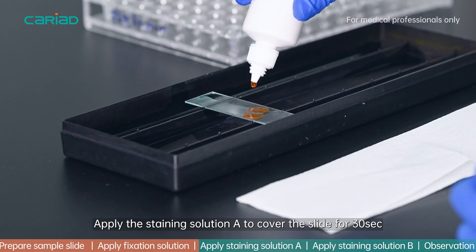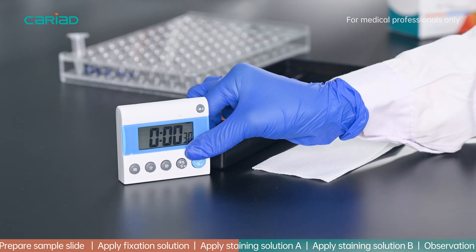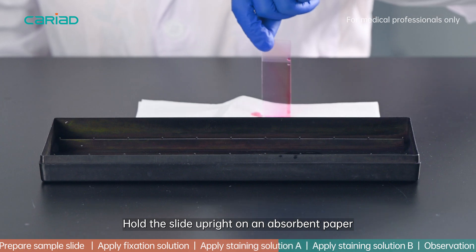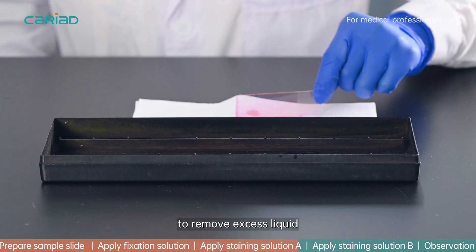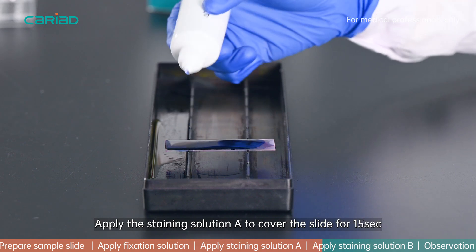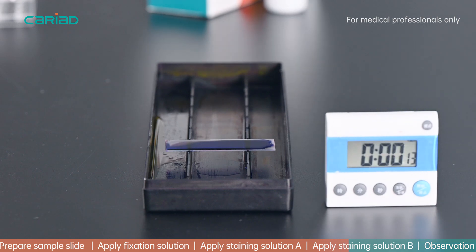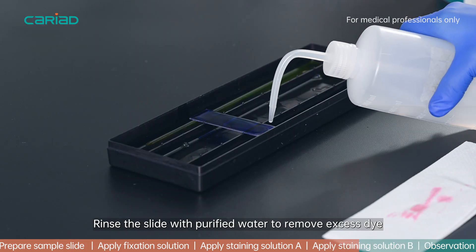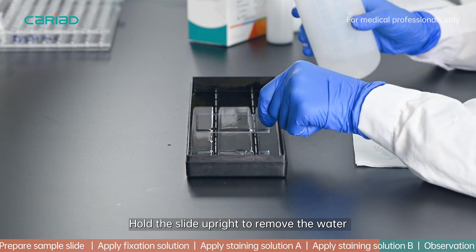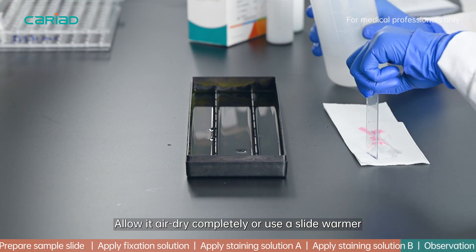Apply staining solution A to cover the slide for 30 seconds. Hold the slide upright on absorbent paper to remove excess liquid. Apply staining solution B to cover the slide for 15 seconds. Rinse the slide with purified water to remove excess dye, then hold the slide upright to remove the water and allow it to air dry completely, or use a slide warmer.